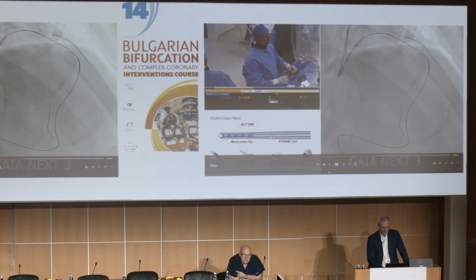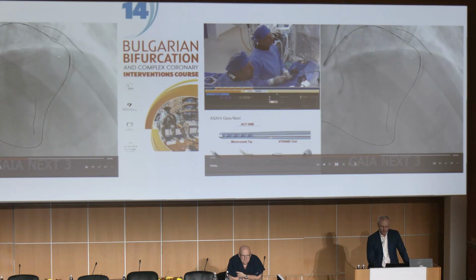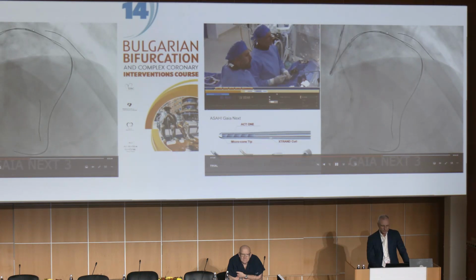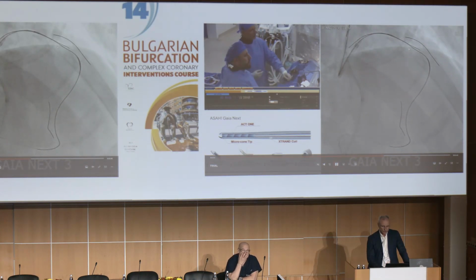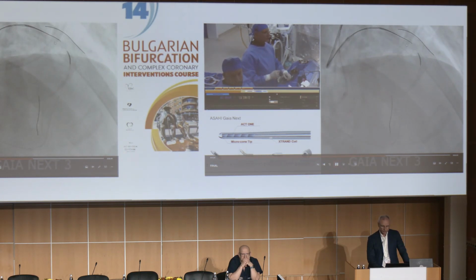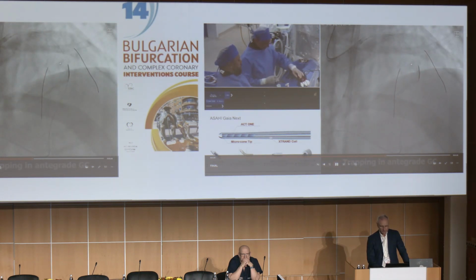Anyway, you see how it worked, and over a certain period of time, the wire that we fought with for 2, 3, 4 minutes engaged the distal cap in a sensible way, and afterwards it was propagated, as you can appreciate here, and crossed the occlusion retrogradely, and we reached the aorta. And you see here in this spot the difference between the successive failures. The antegrade wire went up to a right point, but then afterwards it deviated and went subintimally.